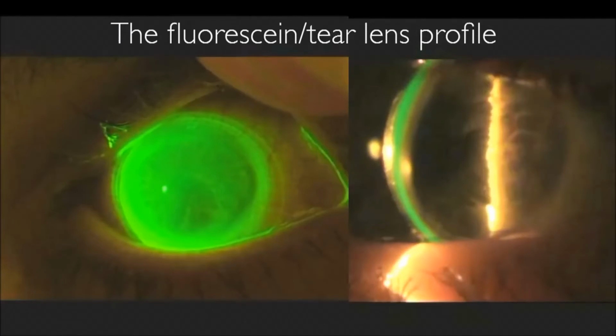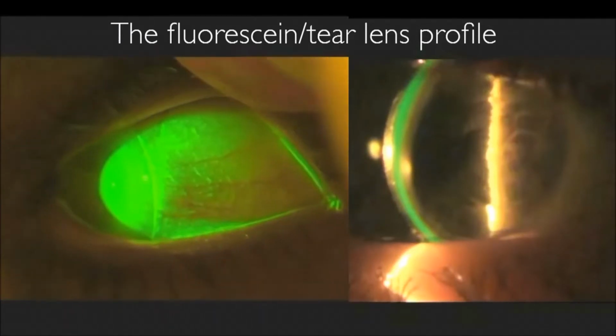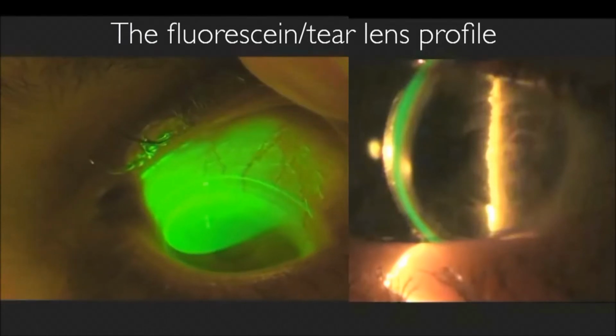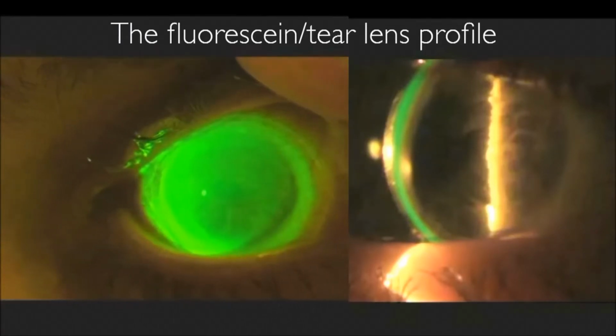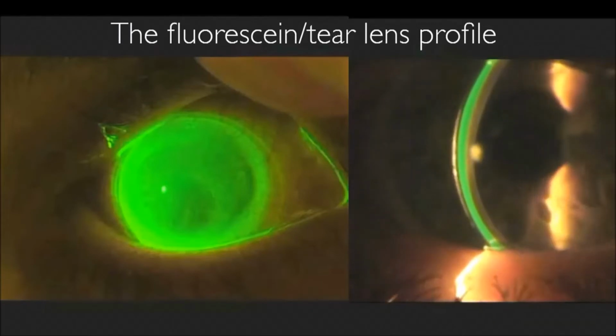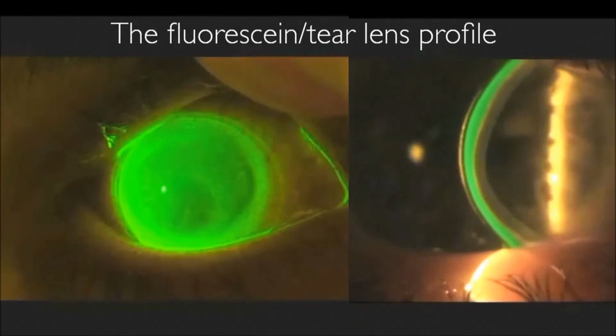On the left, we have our traditional fluorescein pattern, where I'm using cobalt blue filter light from the slit lamp and the yellow enhancing filter in front of the objective of the slit lamp to enhance my evaluation of the fluorescein behind this lens. On the right, I'm using white light, a thin optic section.